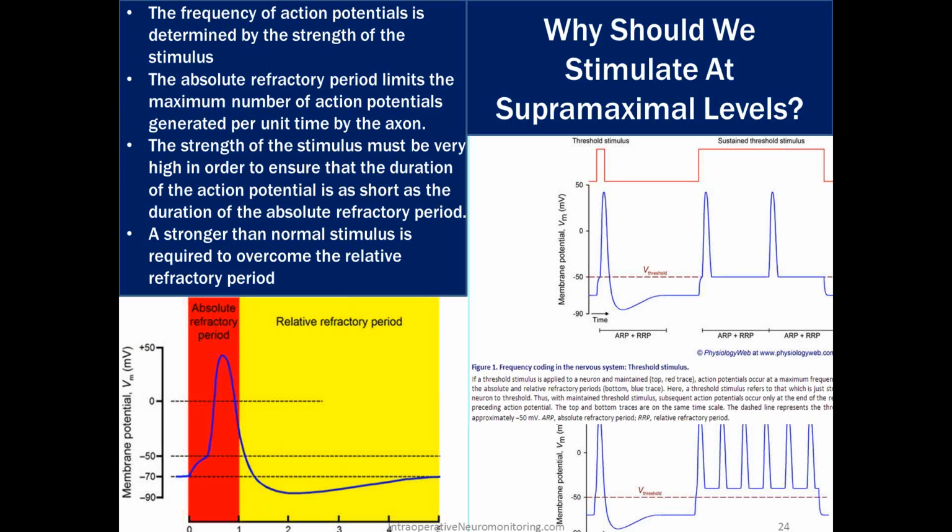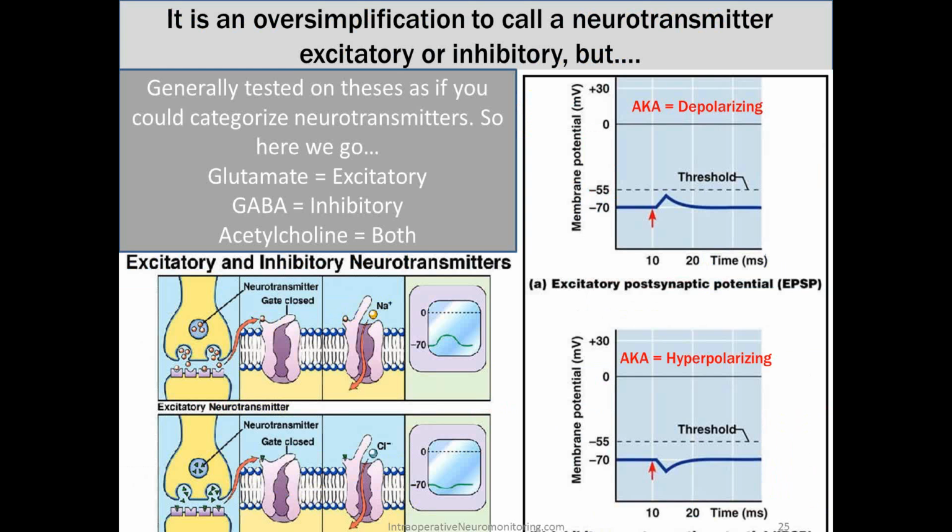And they're doing similar things with bulbocavernosus reflex. You can see that in one of my blog posts. They're looking at it for SSEP stimulation, blink reflex, everything, H reflex, all these things that we used to think had no chance. We're now kind of taking a second look at it because we're utilizing this multi-pulse stimulation and adhering to the absolute and relative refractory periods. That's within our understanding now.